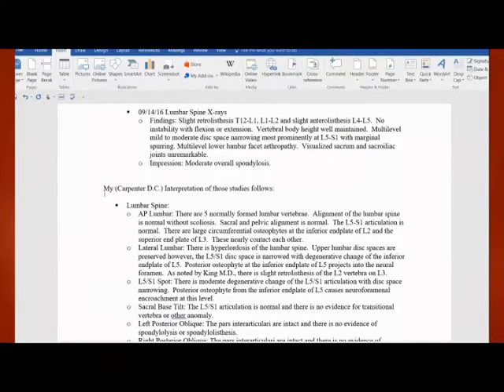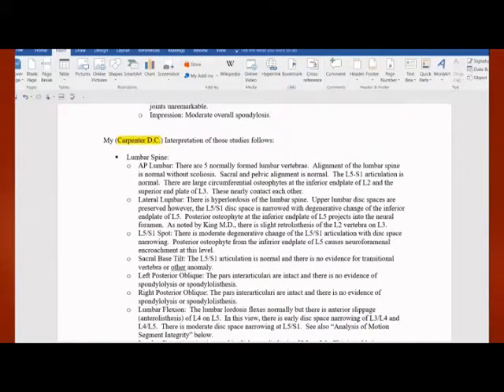Now you also want to review those images yourself. So your template would go something like this. My interpretation, and insert your name right here so the parties are clear on who it is being referred to here in this section. And then provide your own analysis and your own report of findings of the x-ray studies. And if you have any agreement or any disagreement with the medical radiologist, indicate that here in this section of the report. And it's okay to have agreements or disagreements.